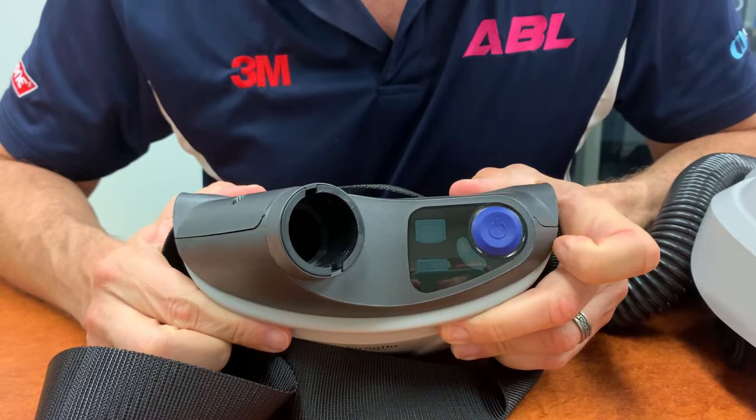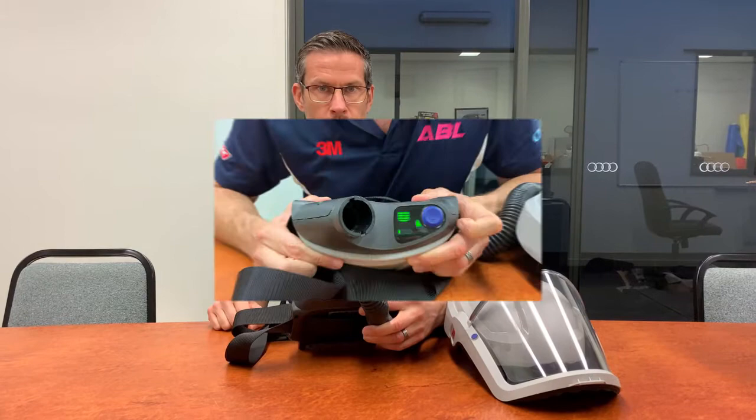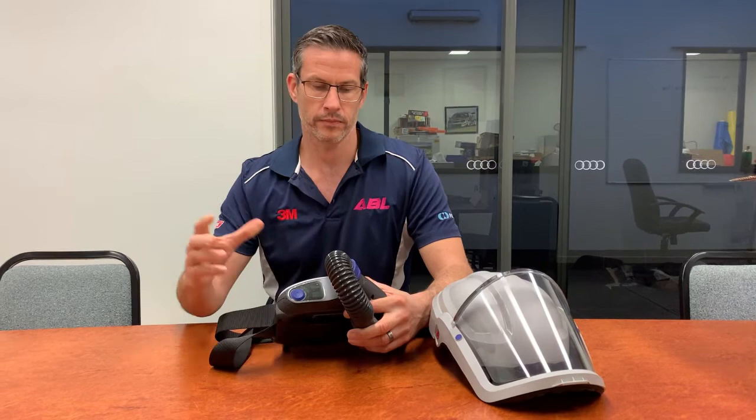The unit will start up automatically once it's done its battery and filter checks. To increase the airflow, simply press the blue button twice, and press again to reduce. To switch the unit off, just press and hold the blue power button. Once you've assembled your unit, it's ready to work.